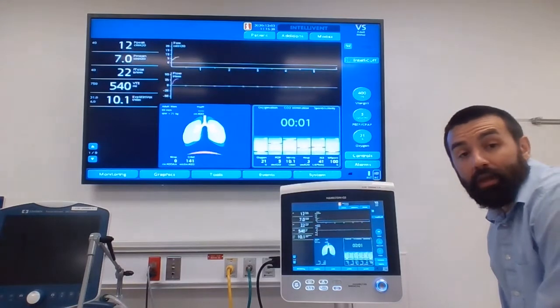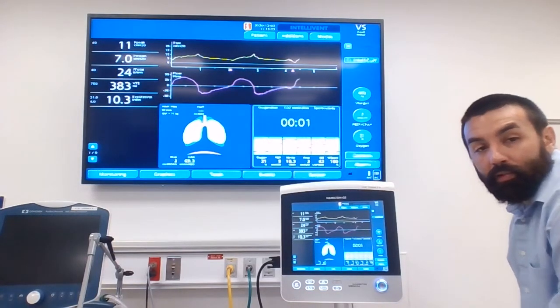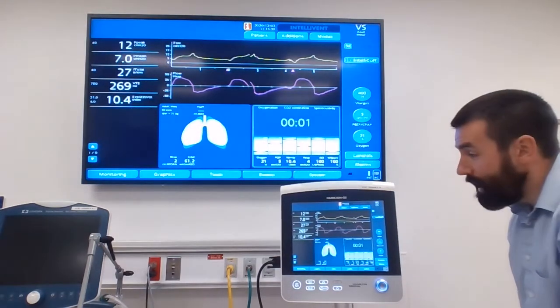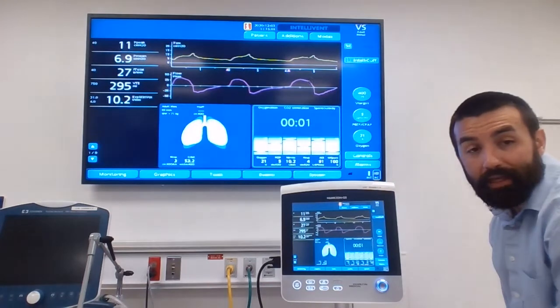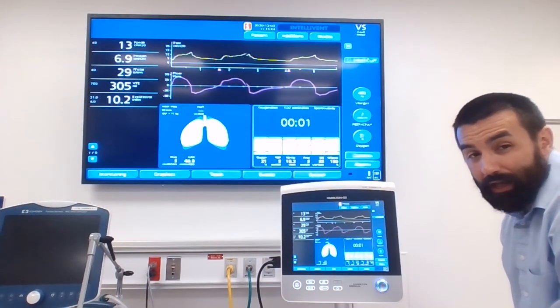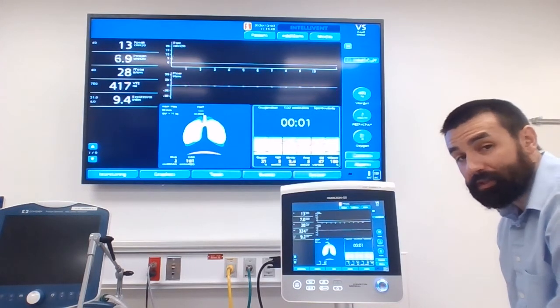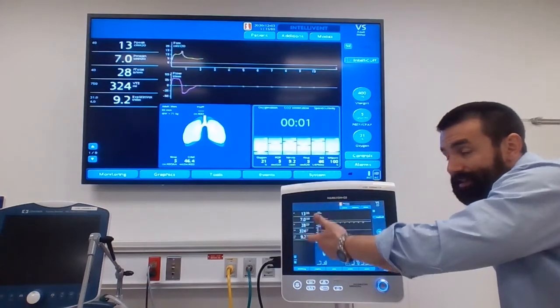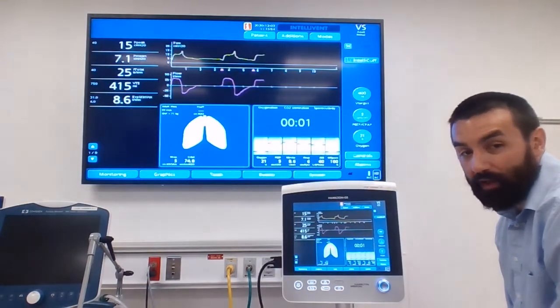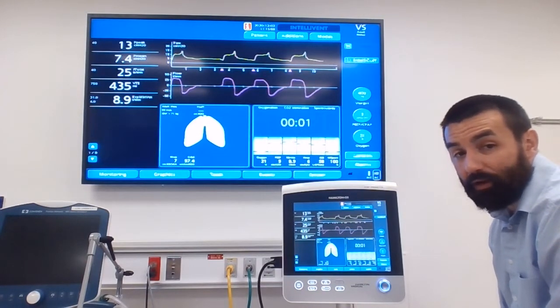So once again, it's just knowing how the mode that you're in, or the way you're delivering a particular control variable to your patient, works, and being able to evaluate the measurements and dictate how that patient's doing. In this case, you could actually extubate them, or consider liberation from the ventilator, in volume support. You just have to recognize that it's choosing how much pressure support to give to reach the tidal volume you selected, rather than the other way around.